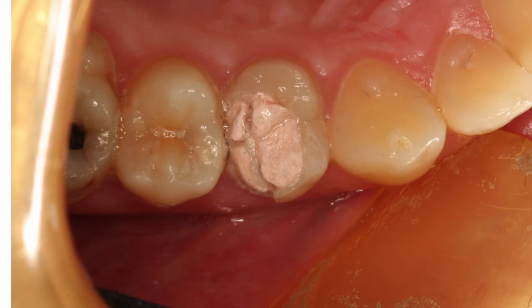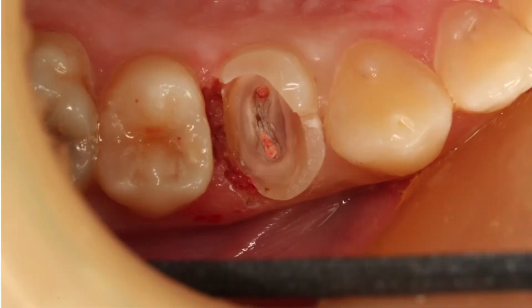And as we look at this next picture, it looks like you had to go in there with your diode laser. Exactly. Yeah, that tissue is hamburger, so I used the diode in there to clean it out so I could see and find a margin. And again, this is one where I'd like to think that every dentist in America would build this up, right? If you don't, there's nothing left.